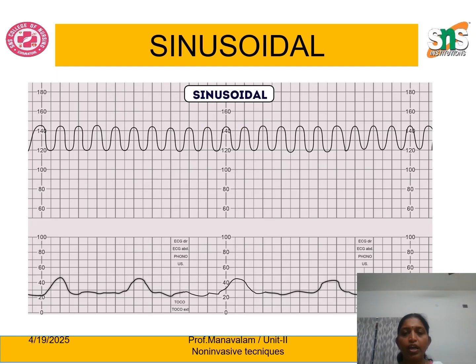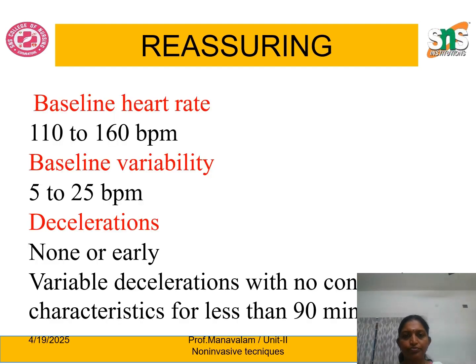This is about the sinusoidal pattern. There is no variation; it goes between only two values. There is no acceleration, no deceleration, no baseline variability, and no variable deceleration. Nothing is there; it goes in the same pattern, and that is called sinusoidal. This is also indicating fetal hypoxia and acidosis.